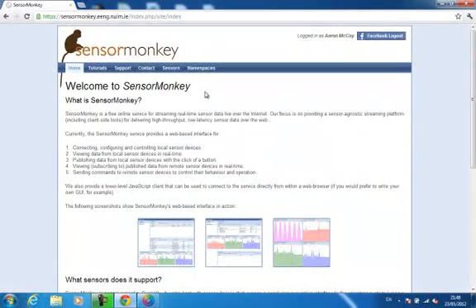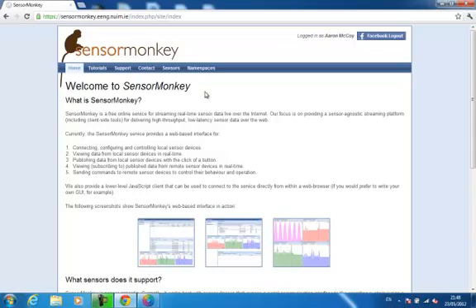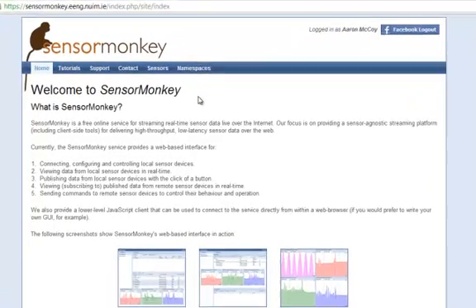To access the web-based control panel, go to the SensorMonkey home page and log in with your Facebook account. Once logged in, you can access your control panel through the Sensors link at the top of the page.